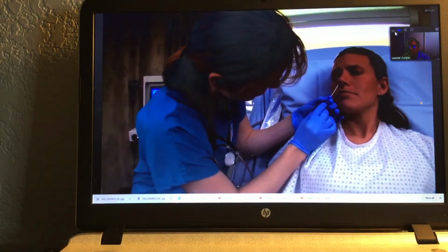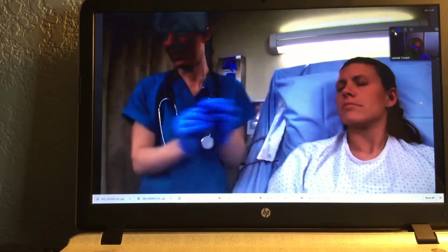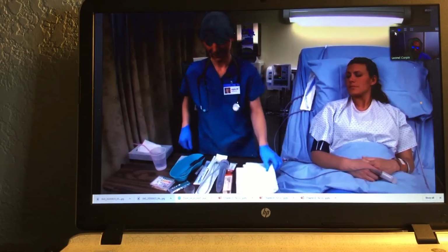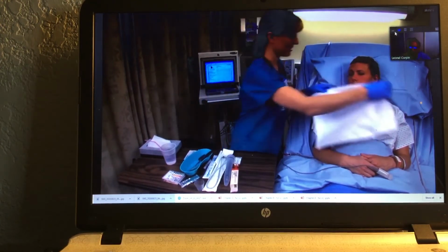I'm just going to set up the equipment. Place a bath towel over your client's chest.